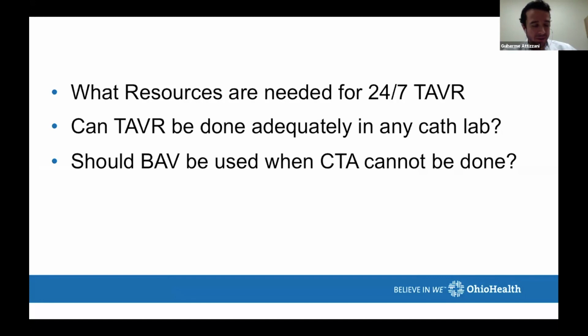I think the situation that you showed, Steve, beautifully showed, and Sushil made a very important comment there, that these patients turn around very quickly, right? I think the only situation where emergent TAVR is reasonable is the situation that you just described, the patient that has a bioprosthesis with acute or subacute AI because of a torn leaflet. And indeed, these patients decompensate very quickly. We've had some cases here. There was a case that I presented on CVI a couple of years ago of a patient that we did a valve-in-valve in a Freestyle. It's really impressive how they recover.